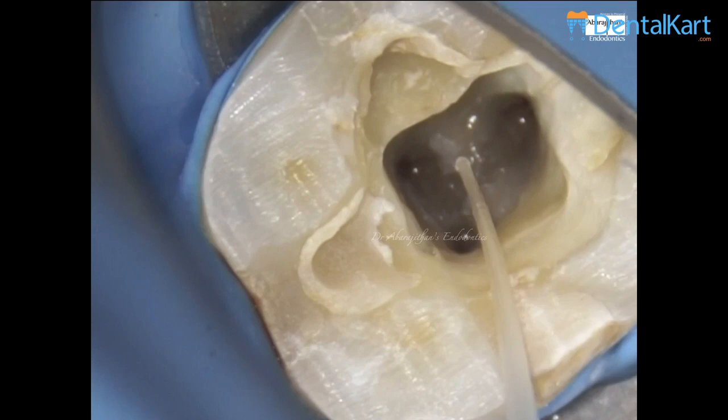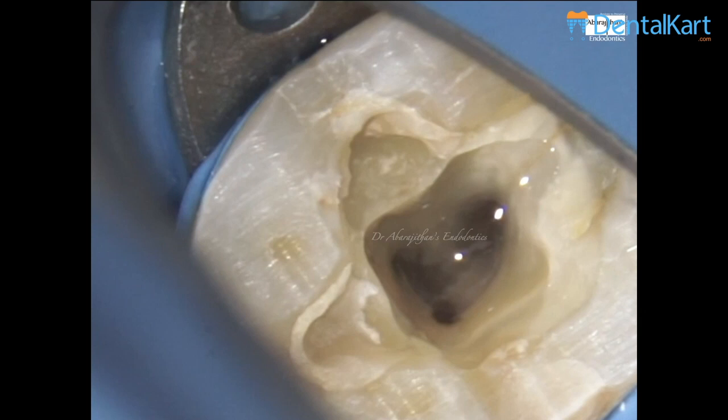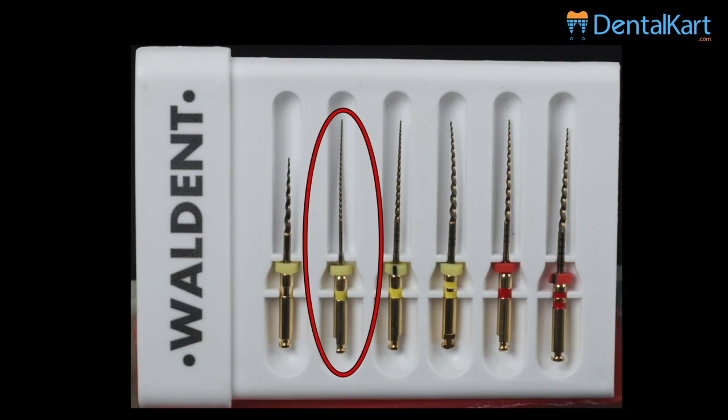Following this we are going to use the subsequent files, but we will never use the file dry in the canal. We placed some irrigant as a reservoir which will act as a lubricant and also reduce the frictional fatigue.